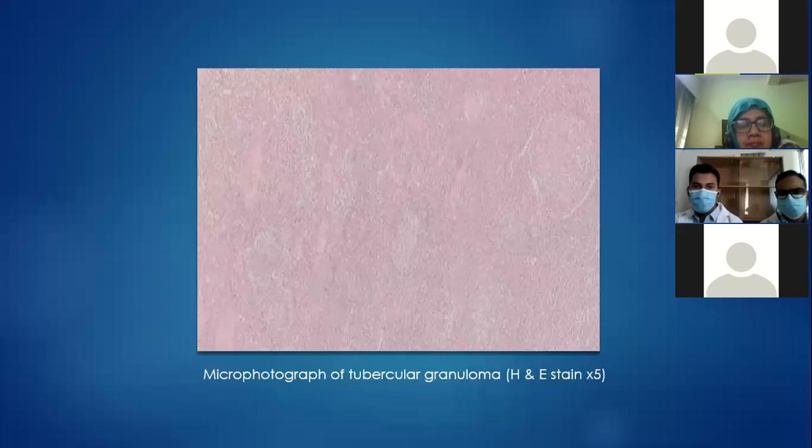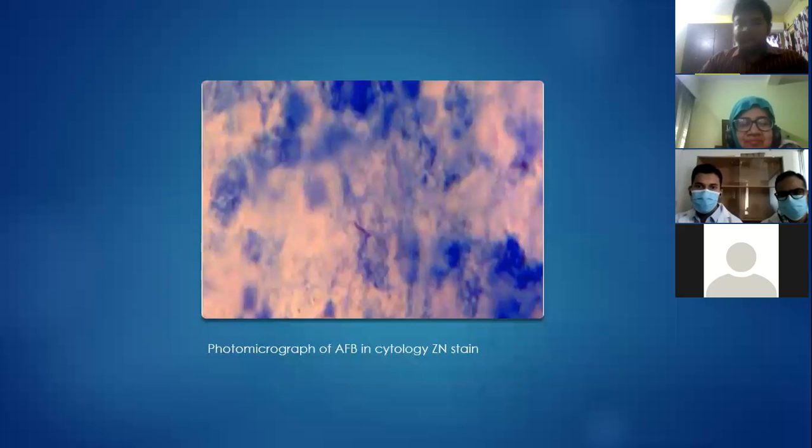This is a microphotograph of a tubercular granuloma with caseous necrosis, which was taken in our department. And this is a photograph of AFB cytology with Ziehl-Neelsen stain.